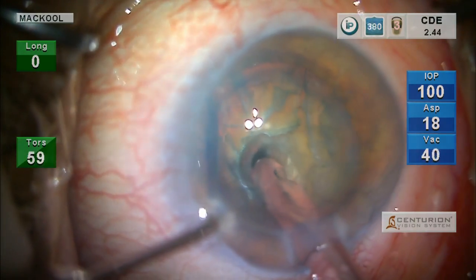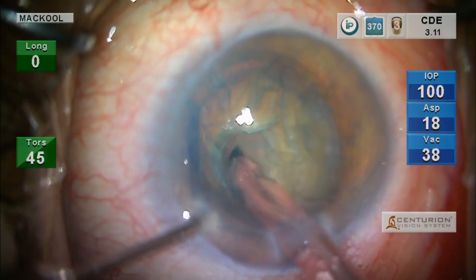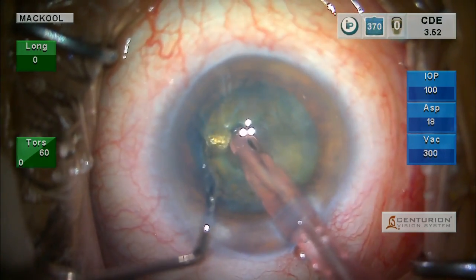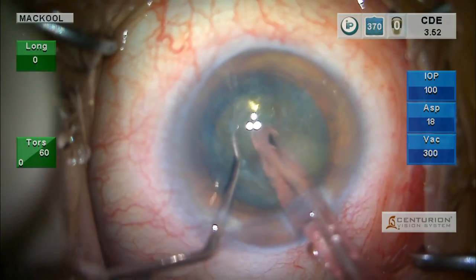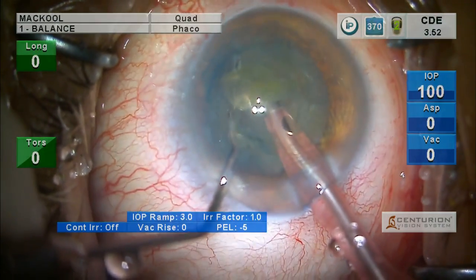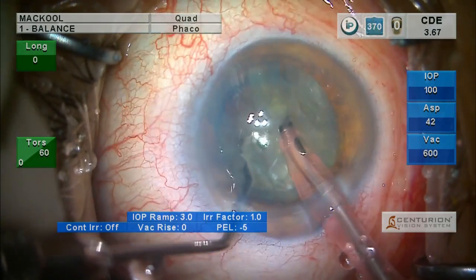Sculpting down until I get a red reflex — it's a pretty large nucleus, you can tell by the steepness of the phaco tip. Now that I've got a good red reflex I can chop, and I'm not going to separate the instruments widely. I really don't want to stress the zonule.